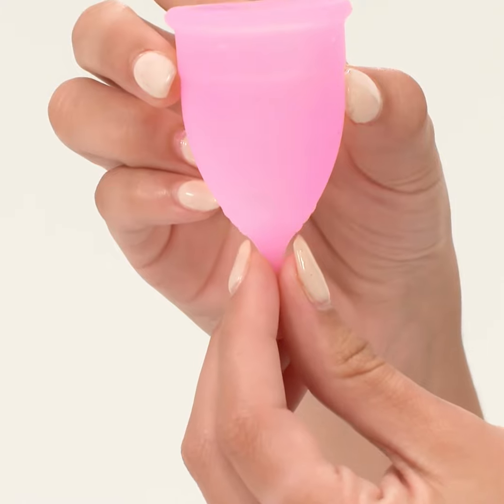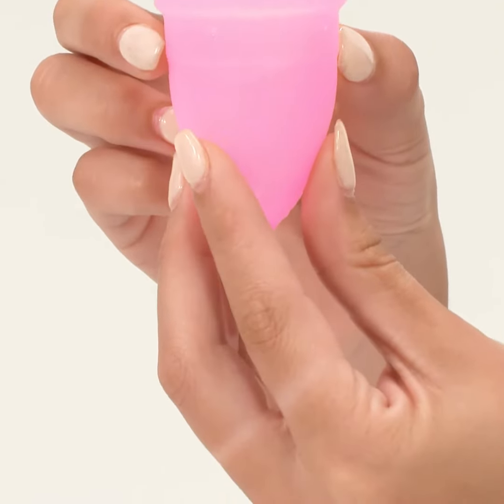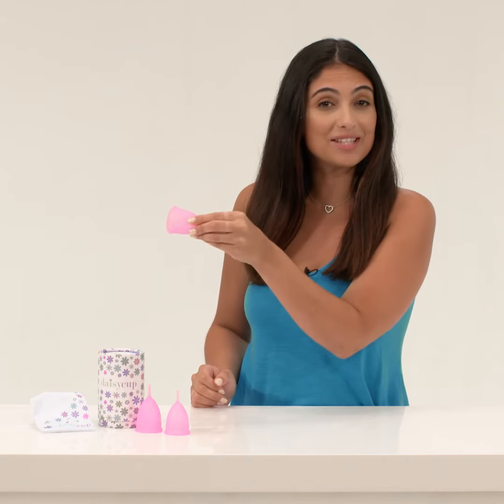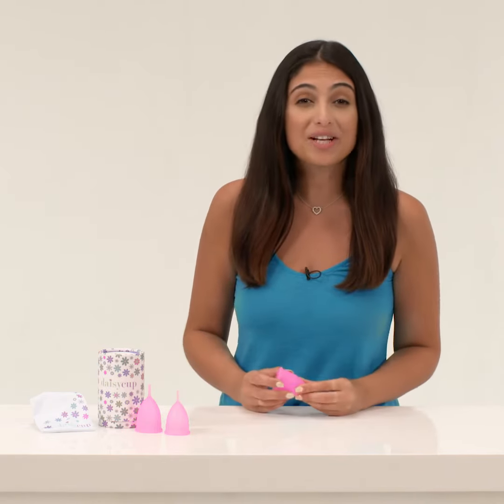Step 5, removal. Make sure your hands are clean. Assume the same sitting or squatting position as before. Hold gently on the stem until you can grip the base of the cup. Gently pull the base out, keeping the cup steady and level. Then, empty the contents into the toilet. Rinse the cup out with water and re-insert if needed.